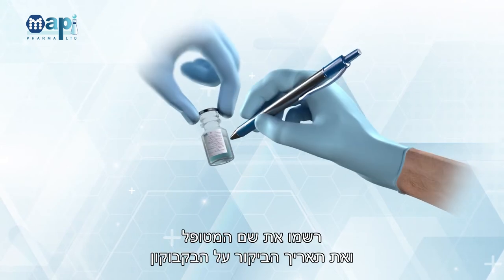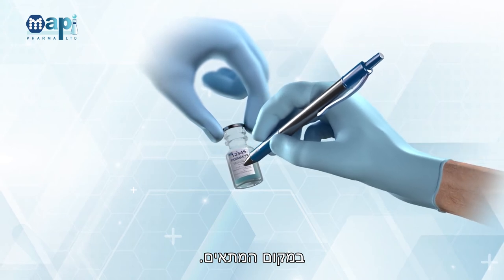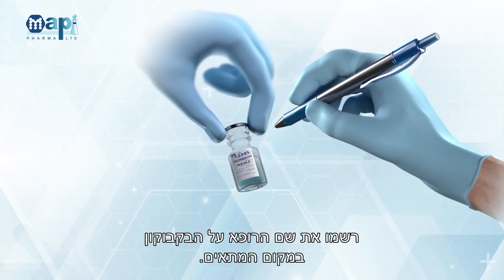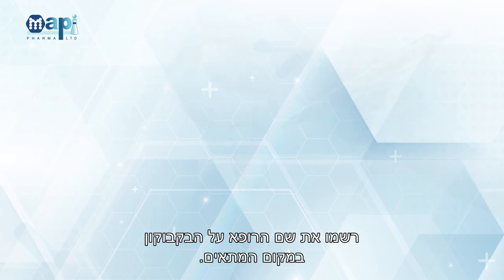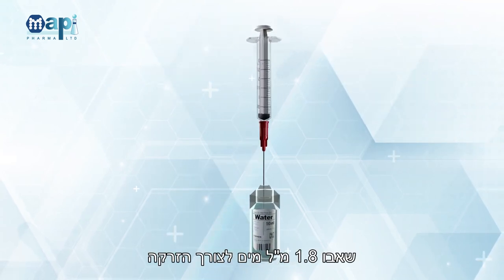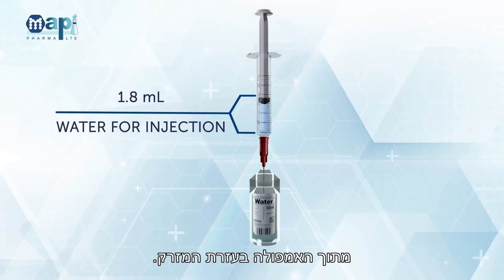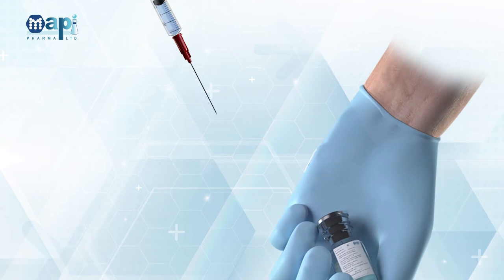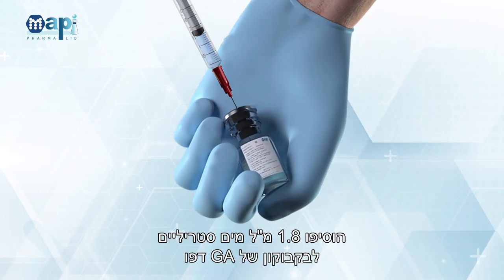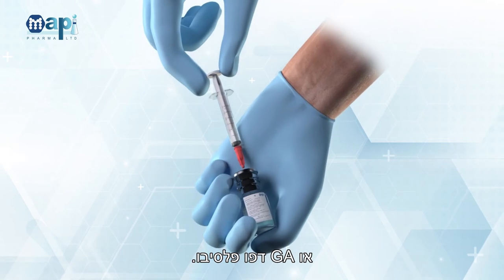Write the subject's number and visit date on the vial in the appropriate place. Write the PI name on the vial in the appropriate place. Attach the suspension needle to the syringe. Withdraw 1.8 mL of water for injection from the ampoule with the syringe. Add the 1.8 mL WFI into the GA Depot or GA Depot Placebo Vial.